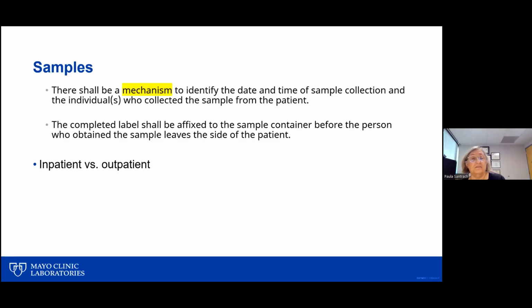And so we can verify things by looking at that as well. And the completed label shall be affixed to the sample container before the person who obtained the sample leaves the side of the patient. Now, inpatient versus outpatient.